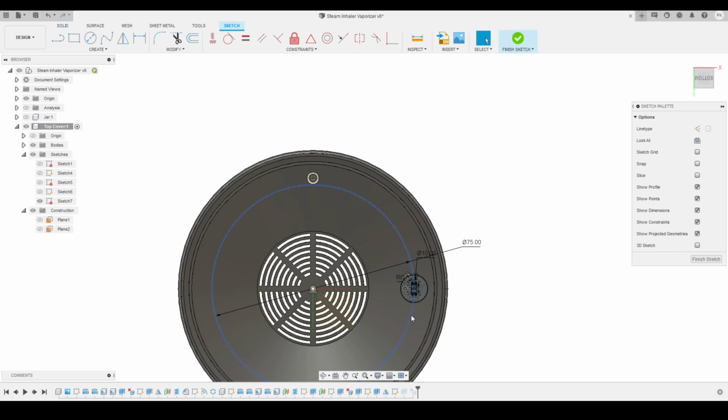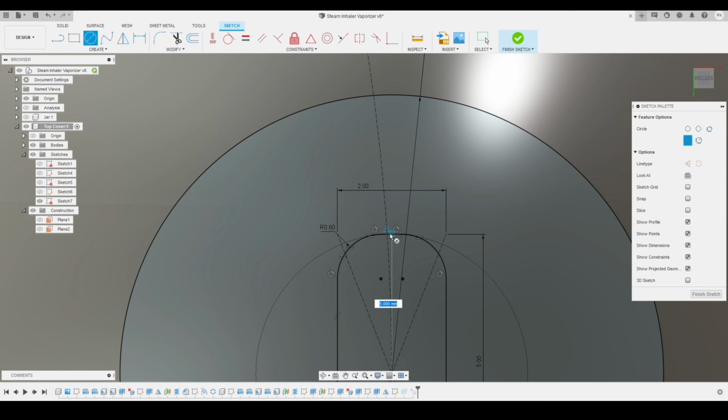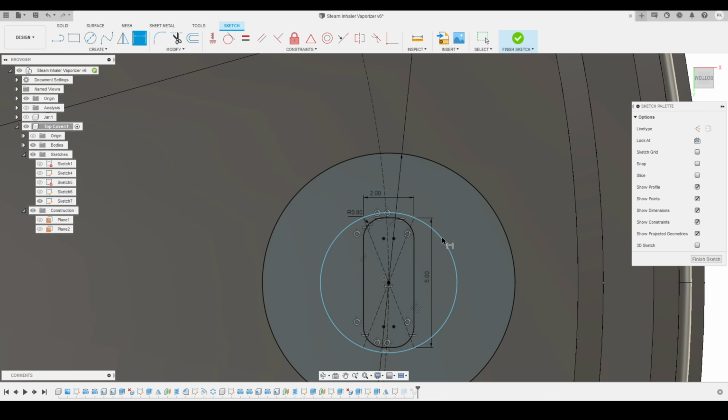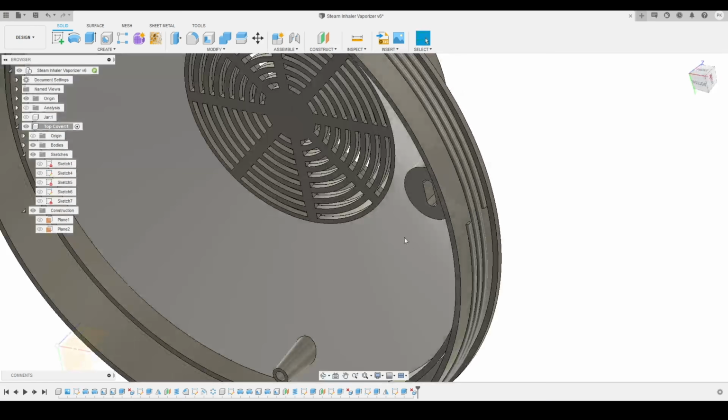And now what I'm going to do is I will activate the sketch again, and we'll create a circle over here on the center that must be covering the complete rectangle. So here you can see this is how I had created. Now I will define the diameter of this circle, maybe 6 millimeter, and we're going to finish sketch.